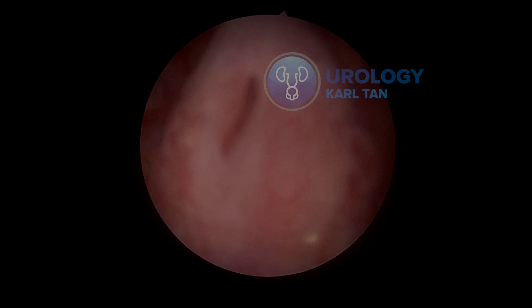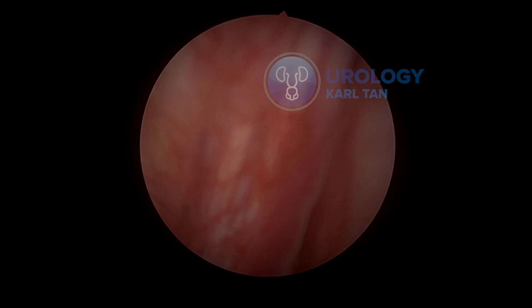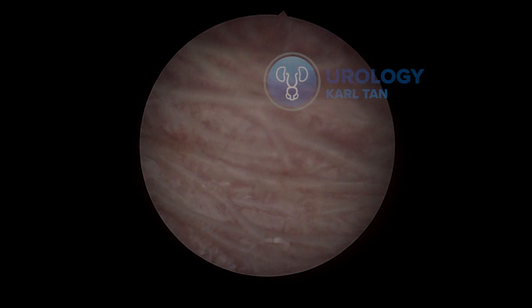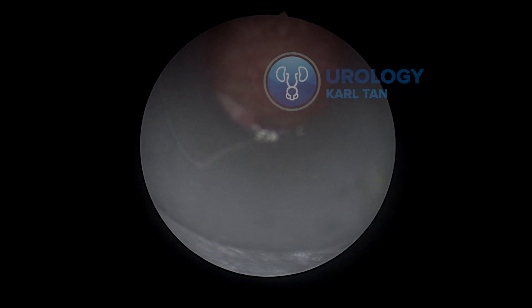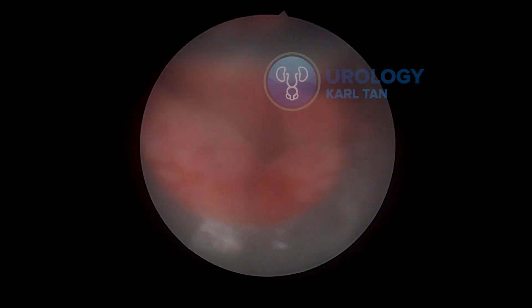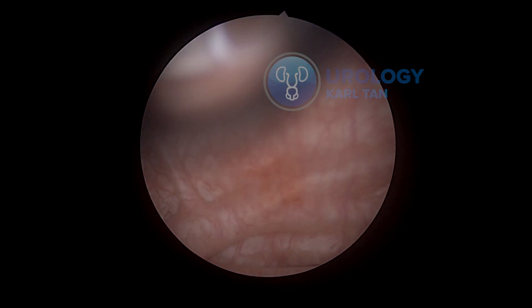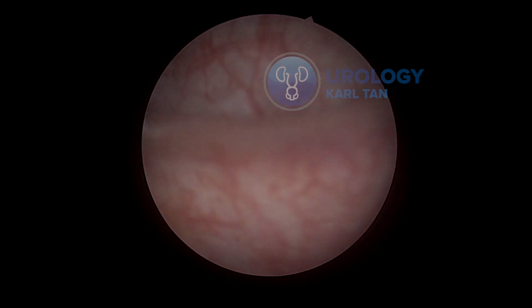This is a case of a 75cc prostate that I did a month ago. I've been using the continuous wave thulium YAG laser, the first generation one, since 2016-2017. I've devised a way to use a low power setting for this — I'm using 30 watts for the setting.